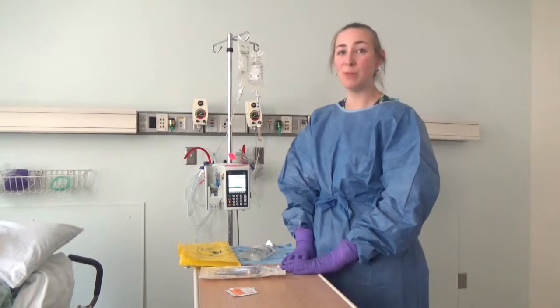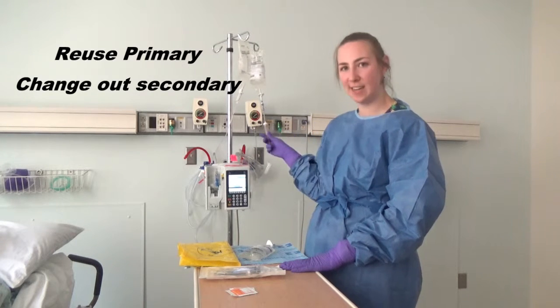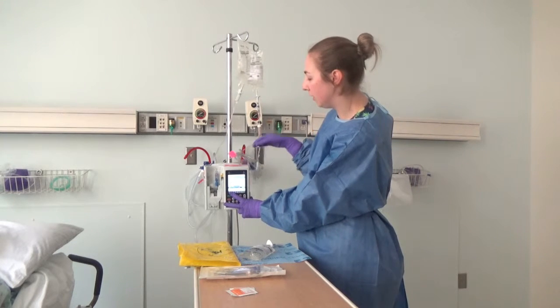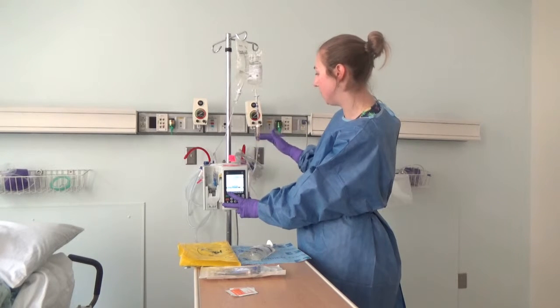For chemotherapy regimens with multiple drugs in sequence, we can reuse our primary tubing and change out our secondary tubing. To do that, you're going to want to make sure you back prime on the pump to clear your secondary chemotherapy tubing from any trace chemo, just up to the chamber.